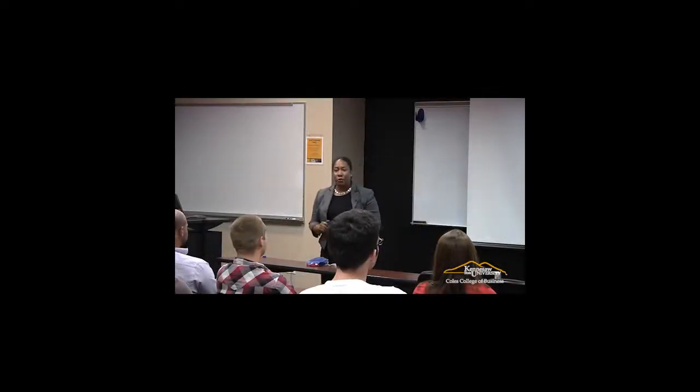If I ask you, do you want, Billy, pepperoni on your pizza? What would be your response? Yes. Okay, so Billy's going to concentrate on yes, and as he watches the yes flashing at 10 hertz, as I monitor the area in the back of his head, I will see 10 hertz flashing and know that he intends yes. So I highlight this in this manner.